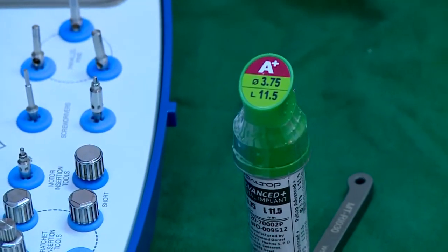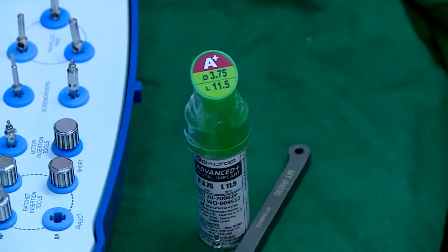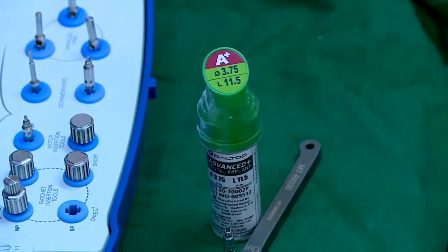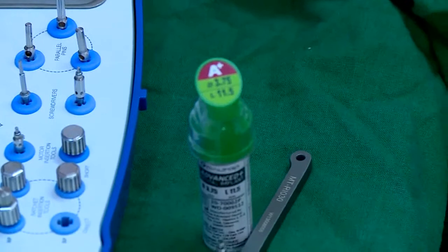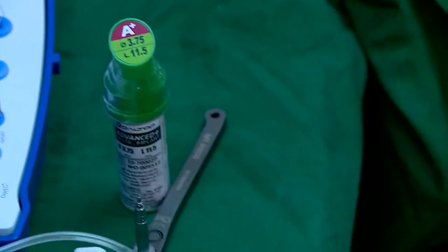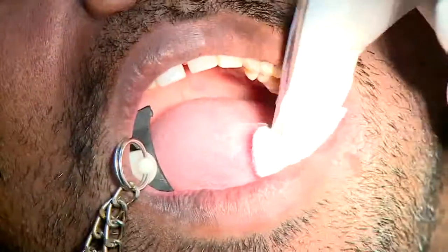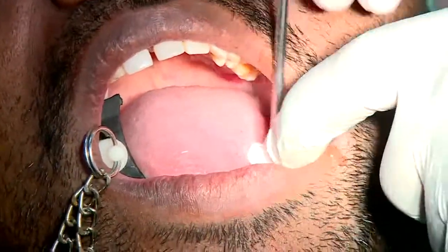So you're planning to place 3.75? Yeah, 3.75, length is 11.5. Now, though I have a crestal height of about 14 millimeters, the only problem is because of the way the resorption has happened, we might sometimes end up taking out the surface. We might have to trim out the crest, which if it is knife edge, to make it a small plateau, and then start your implant procedure. So this is more of a preparatory step.